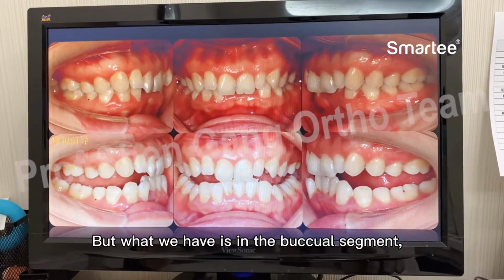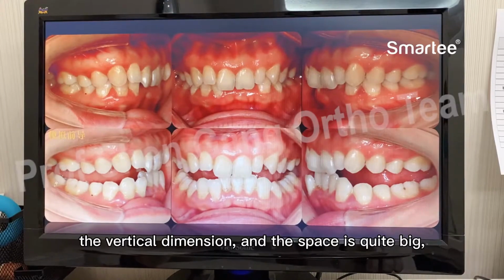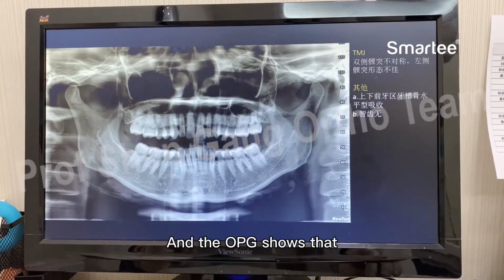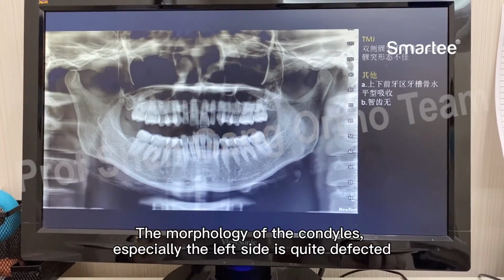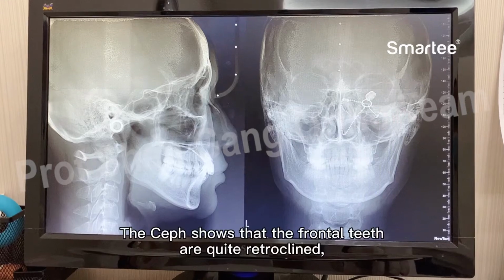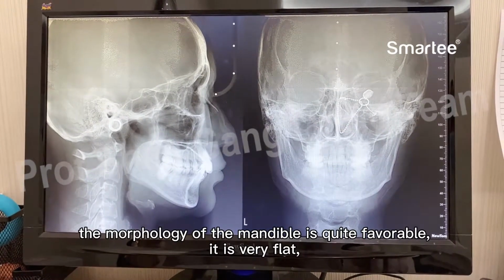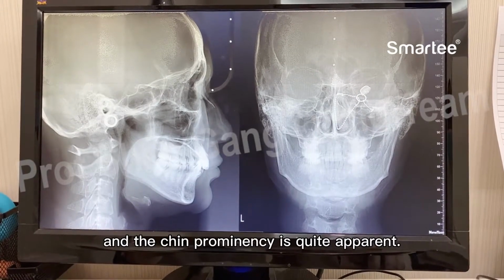But in the buccal segment, the vertical dimension, the space is quite big, indicating a very deep curve of Spee. And the OPG shows that the condyles on the two sides are not very symmetrical. The morphology of the condyles, especially the left side, is quite defective. The cephalometric film shows that the frontal teeth are quite retroclined, and the morphology of the mandible is quite favorable. It's very flat, and the chin prominence is quite apparent.